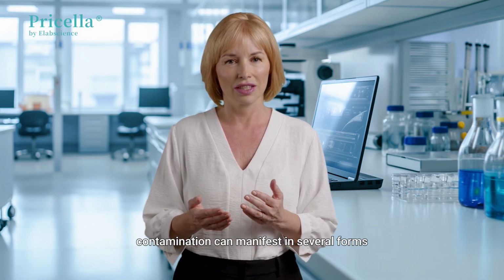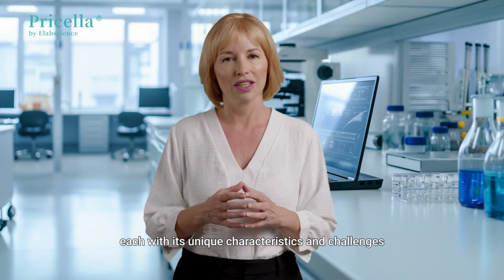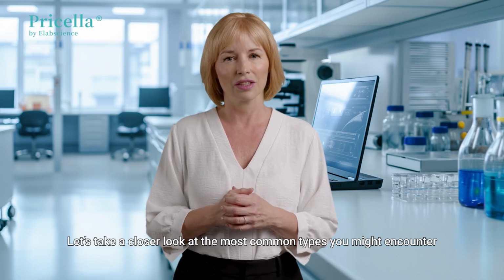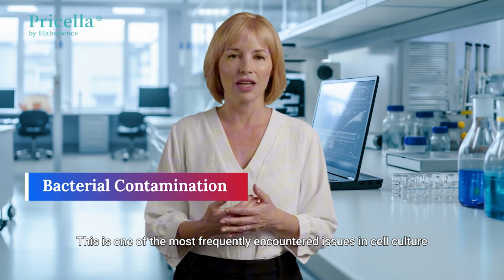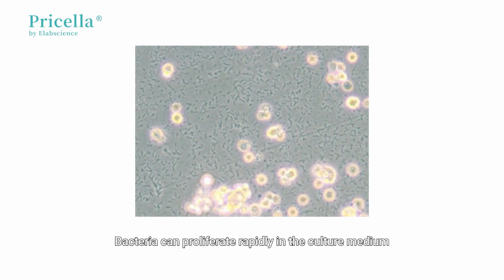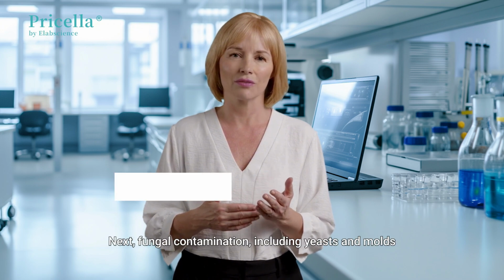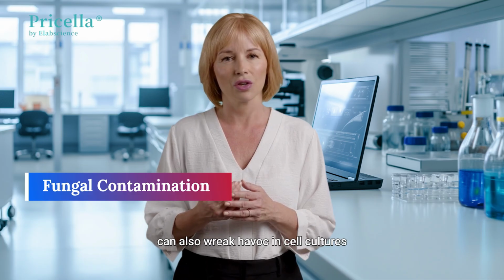In cell culture, contamination can manifest in several forms, each with its unique characteristics and challenges. Let's take a closer look at the most common types you might encounter. First, we have bacterial contamination. This is one of the most frequently encountered issues in cell culture. Bacteria can proliferate rapidly in the culture medium, causing noticeable turbidity and changes in pH, which can lead to compromised cell viability.